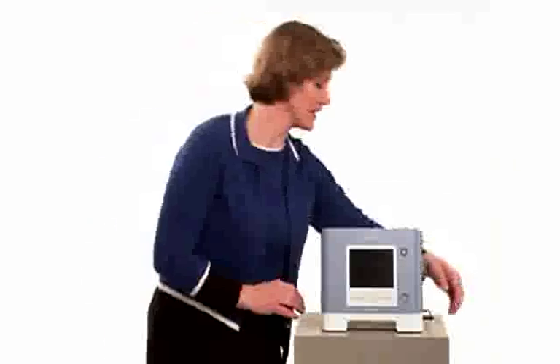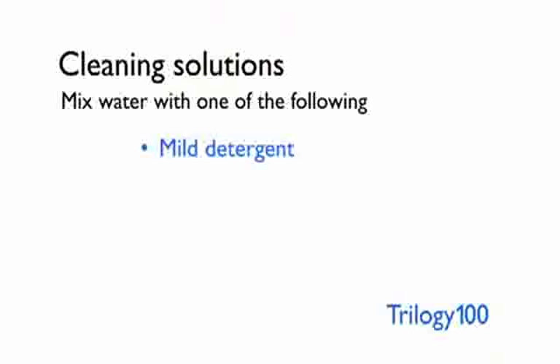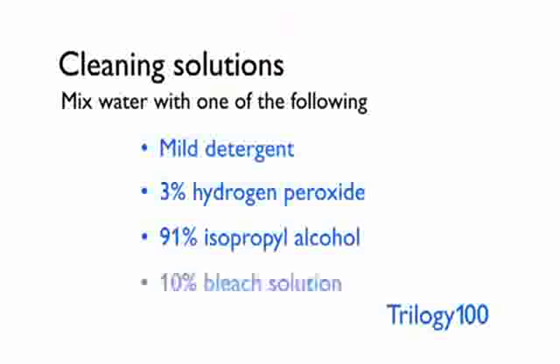The Trilogy 100 ventilator is a medical device, so it is important to keep it clean. To avoid electrical shock, begin by unplugging the ventilator. You can wipe down the outside of Trilogy with water mixed with one of several cleaners: mild detergent, 3% hydrogen peroxide, 91% isopropyl alcohol, or a 10% bleach solution. Dip a rag into the cleaning solution and wring it out until it is just damp, not dripping wet. Wipe down the outside of the ventilator and detachable battery pack, being careful not to allow liquid to drip inside. Be particularly cautious when cleaning the display, as it can be scratched by abrasive cleaners. After washing, use a soft dry cloth to remove any residual cleaner. Allow the device to dry completely before plugging in the power cord.